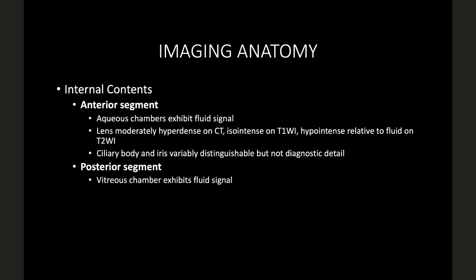So anterior segment, we already went through it. The reason I went through the anatomy is because I want you to understand why the signal looks the way it does. So aqueous chamber predominantly has fluid, right? So it has a fluid signal and fluid signal on MR is going to be what? Can someone tell me? How does your CSF look on MR?